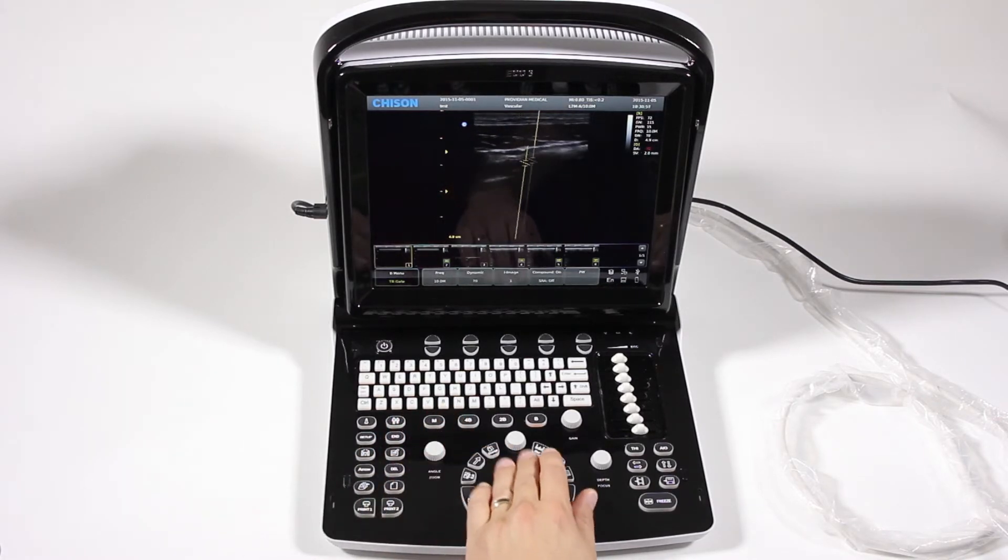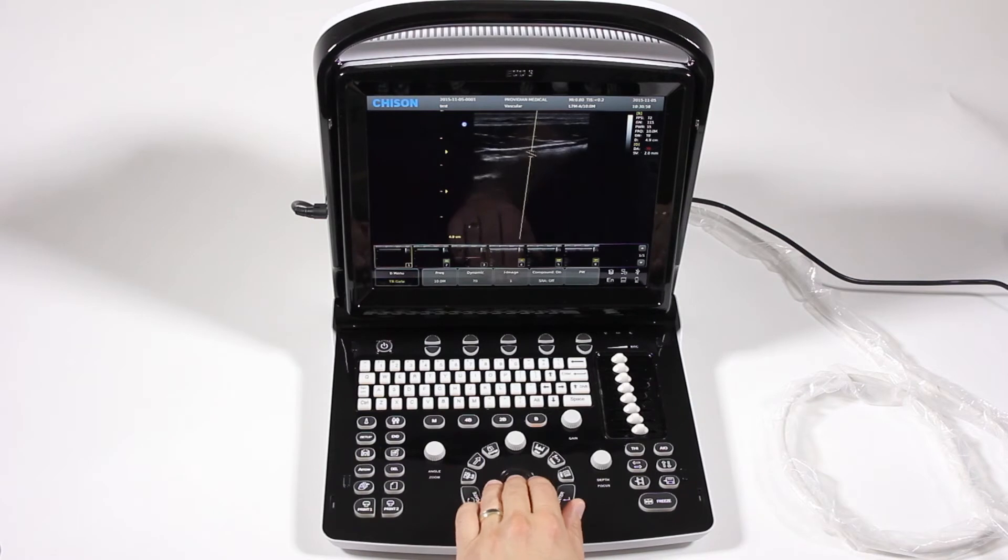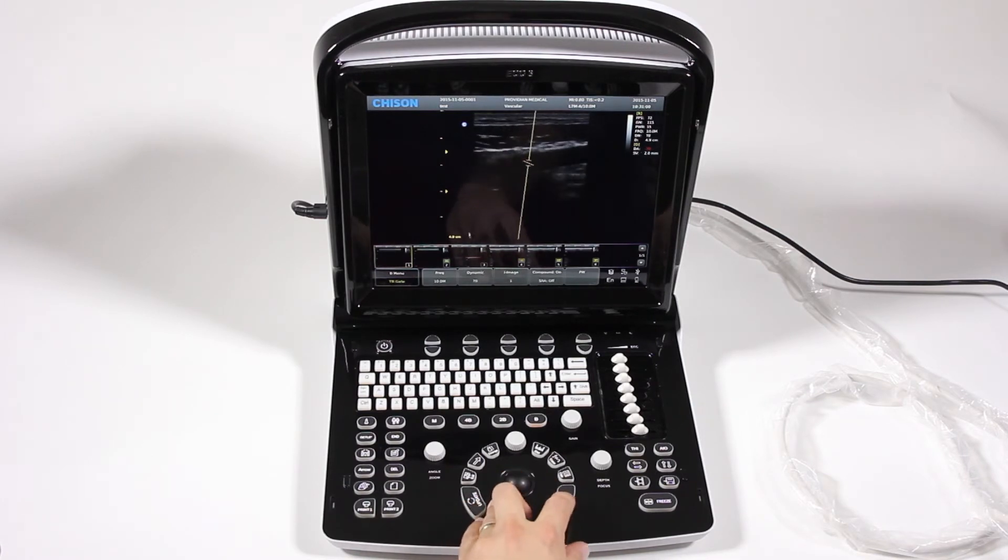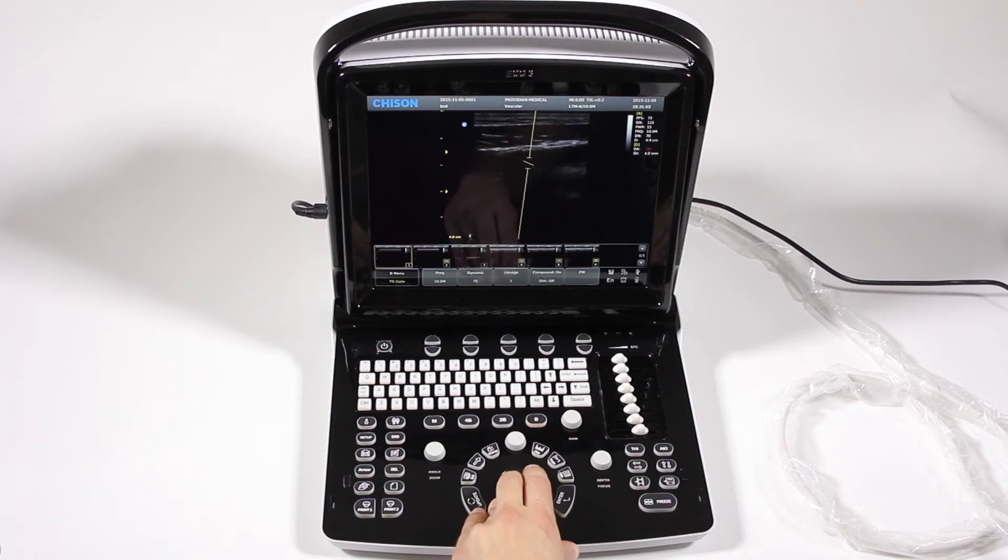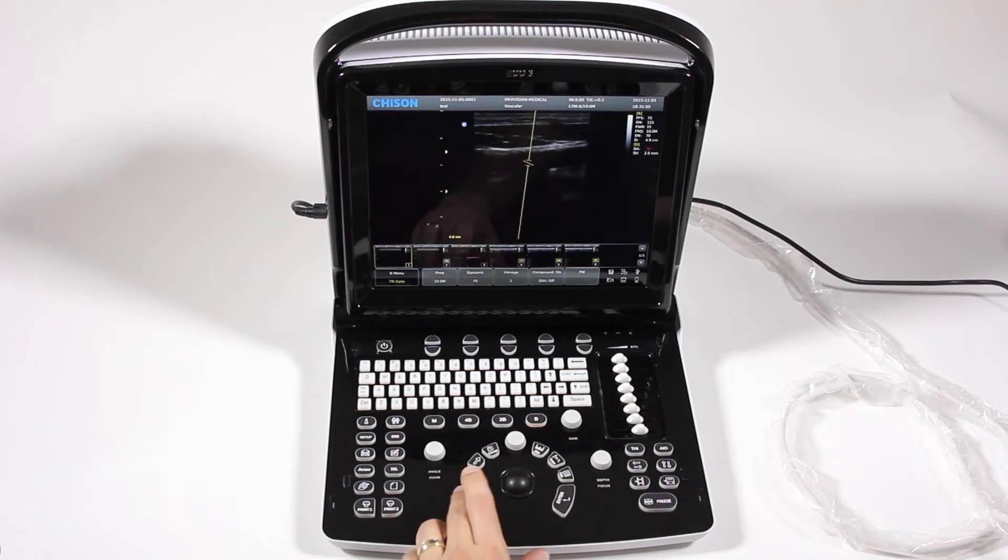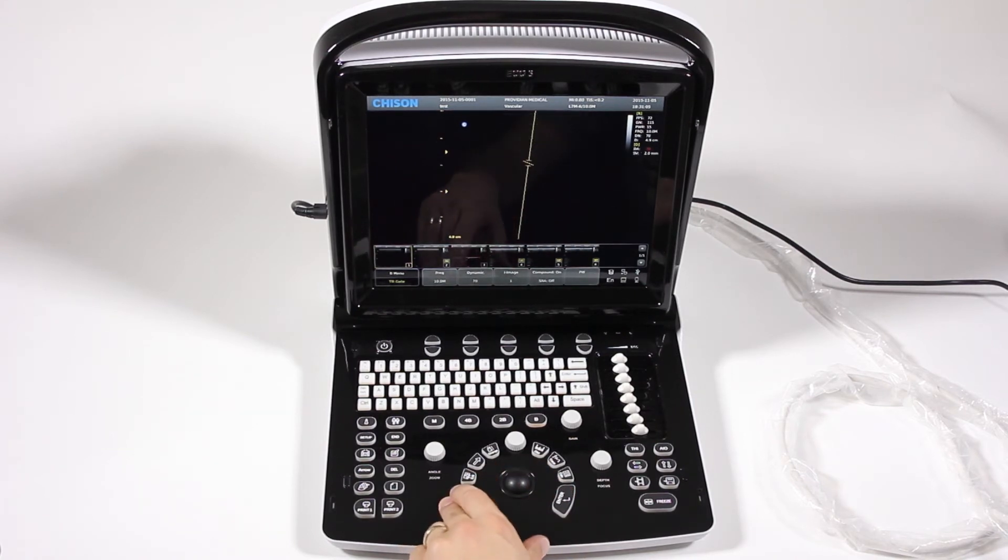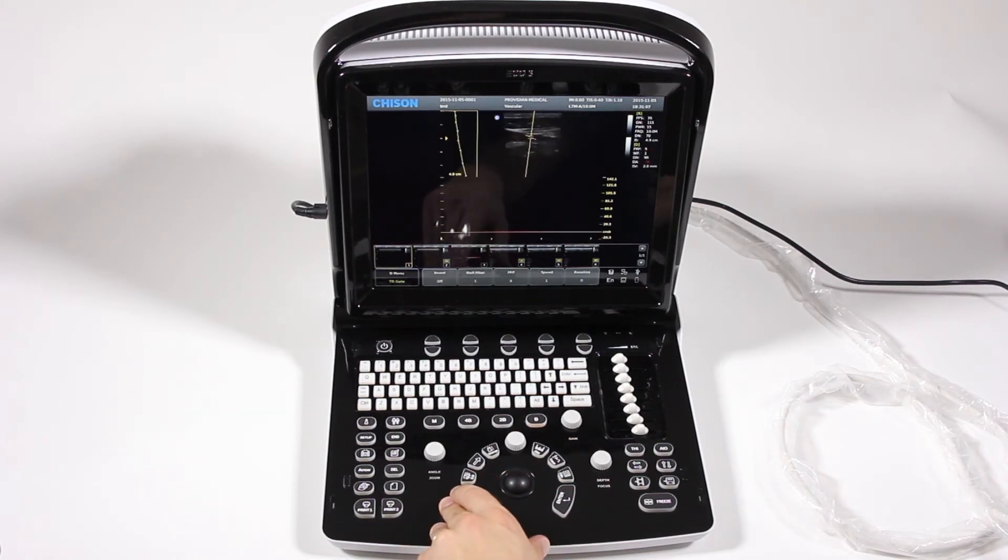You can use the trackball to adjust the position of that gate, and you'll push enter to change the size of the gate. You'll click Update to enter into Pulse Wave Doppler mode.